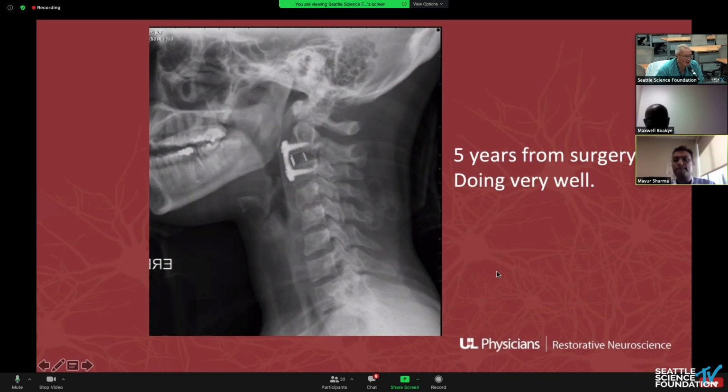So this is a great example of an anterior surgery that shows the penmanship of a really thoughtful surgeon. The reason why I'm saying that is that the plate was beautifully contoured. This is a difficult surgery, and it can be a very difficult surgery in a larger patient, obviously because of the mandible. You wouldn't happen to have an AP in your PowerPoint, would you?